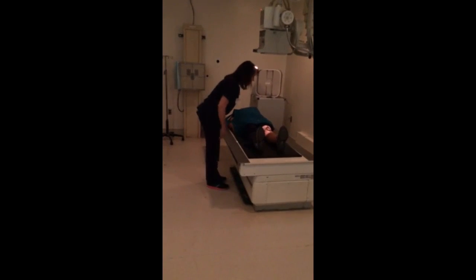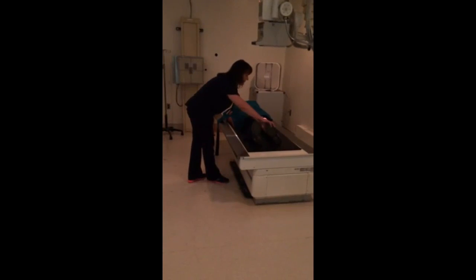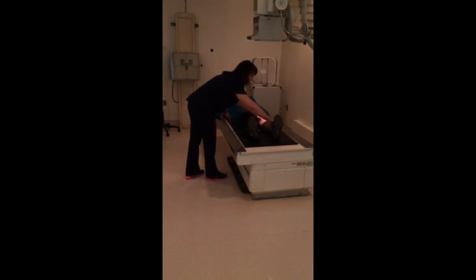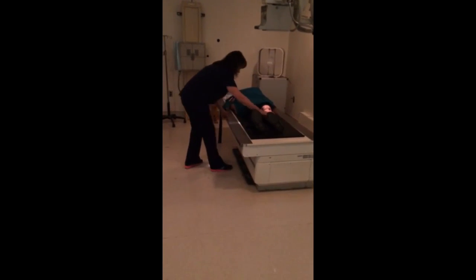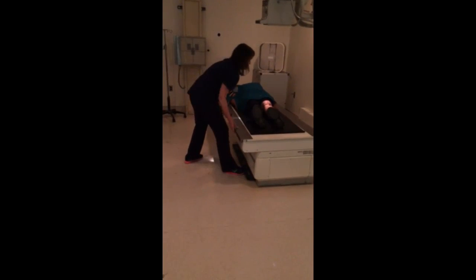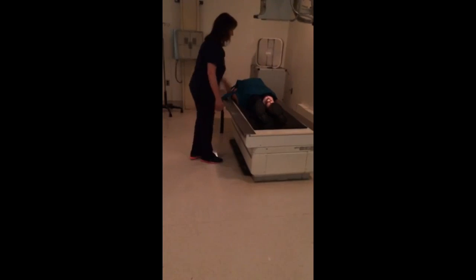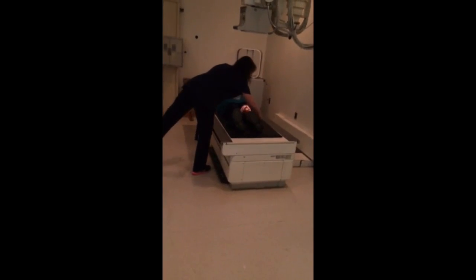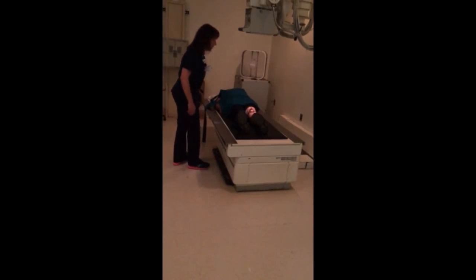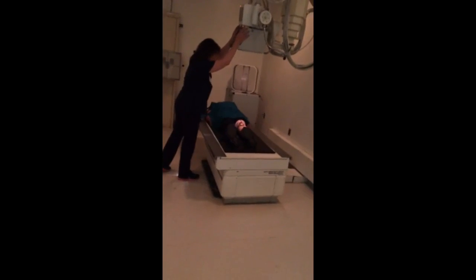This time, I'm going to take the entire leg and we're going to rotate it internally 45 degrees. So let's try that one more time. So I'm going to take the whole leg, internally rotate 45 degrees. Good. Now, again, central ray is entering a half inch inferior to the patellar apex. Markers on the lateral side. Collimate as much as possible. Open up my field just a little bit.